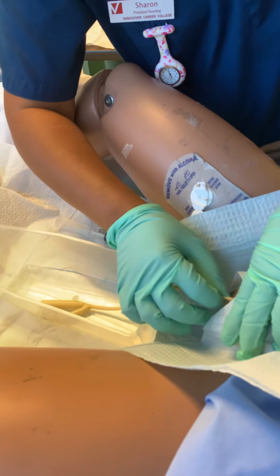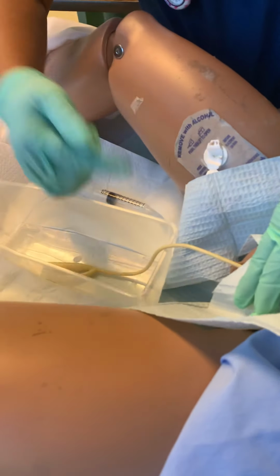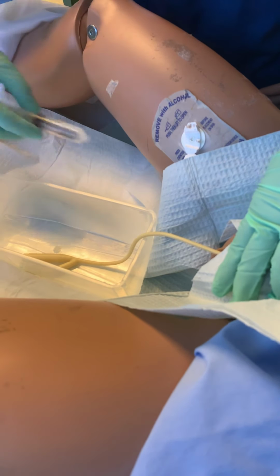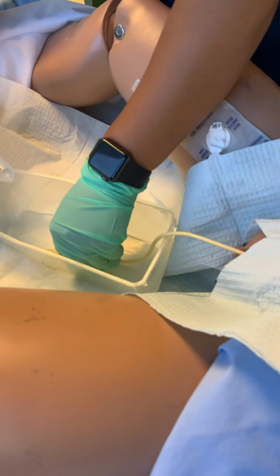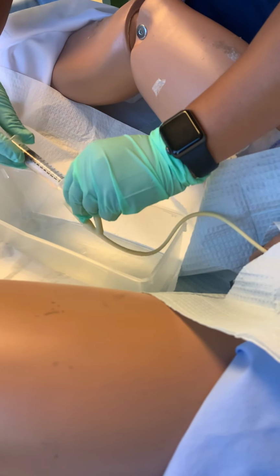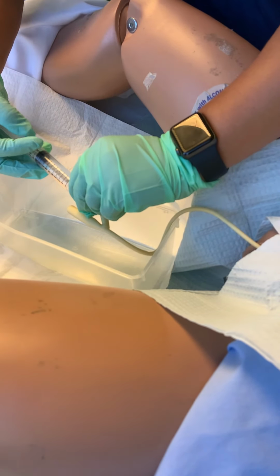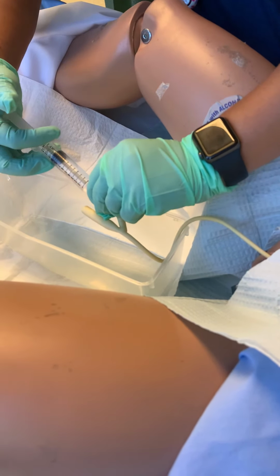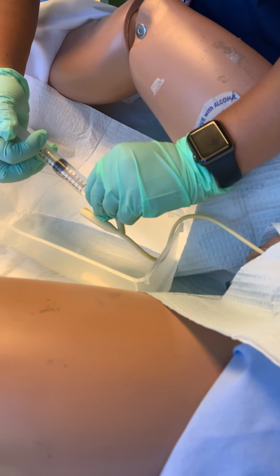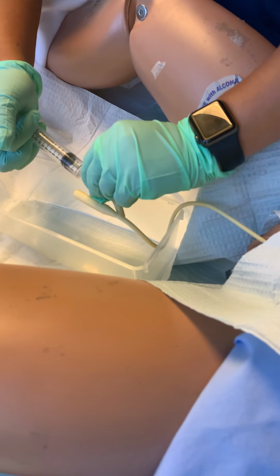Okay. Now I have to push more. If I can see gold urine, that's the time I can advance 2 more inches. Sorry, inches. And now I can inflate my balloon. So bear down, Mrs. Smith. Bear down. No, you don't have to tell anything. No, inhale, exhale. That one is when you're putting it in. After you're done putting it in, then you don't ask anything. Okay. Check for facial grimacing if they're feeling pain or something. She looks okay.